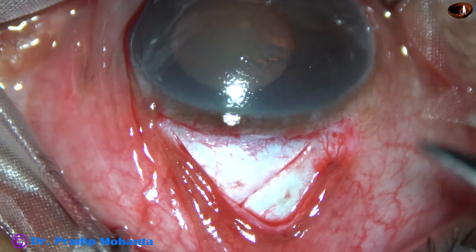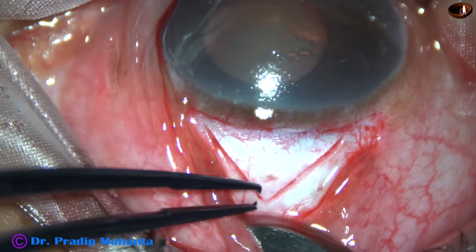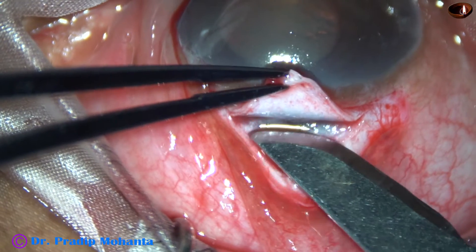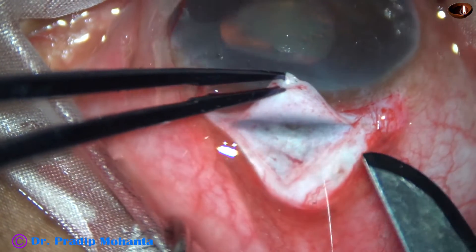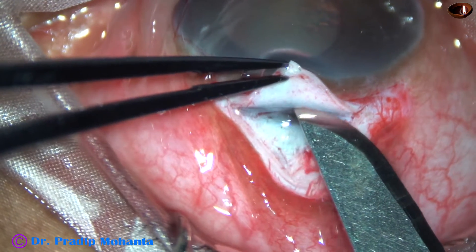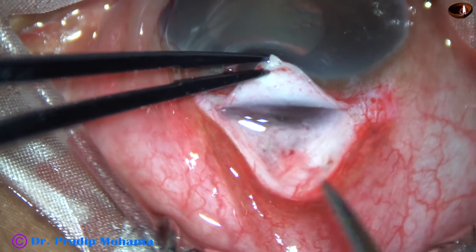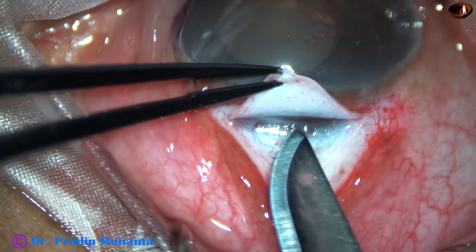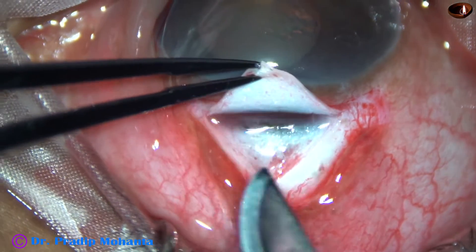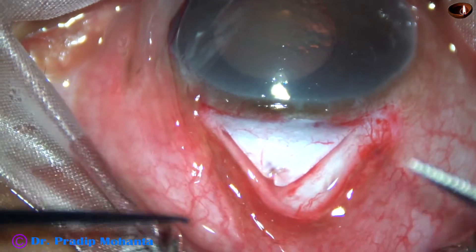Now I have taken a number 15 Bard-Parker blade. I lift the flap and find that I have gone almost three-quarters depth. So now I am using this instrument — a number 15 Bard-Parker blade — to go at the limbus.